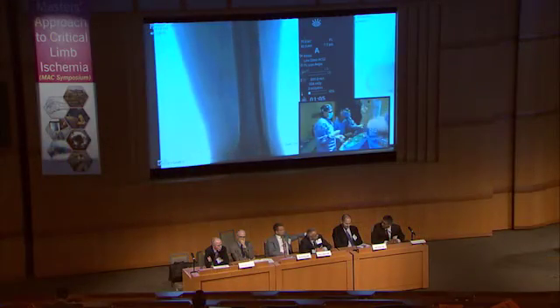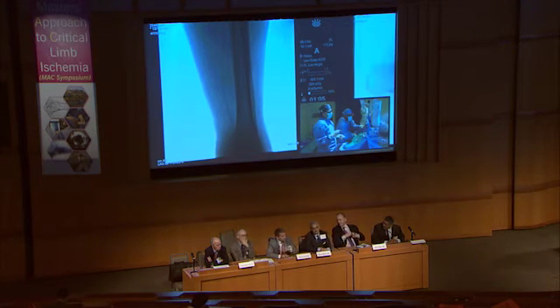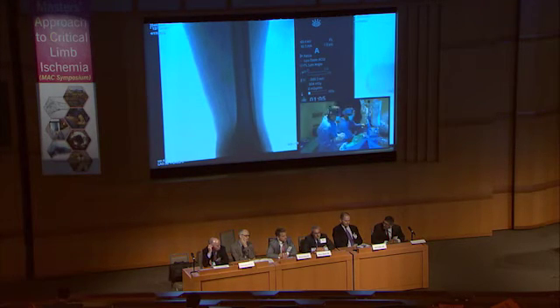So Bruce, you go for the PT? The problem is getting the biggest conduit down there and leaving some stenotic disease behind is going to be problematic, and with that heel wound, you're going to need patency for months. So this PT is going to need to stay open for a long time, and that's the reason I think Dr. Zeller is promoting doing both as well, because if you're going to dilate the whole posterior tibial artery, how long is that thing going to stay open?